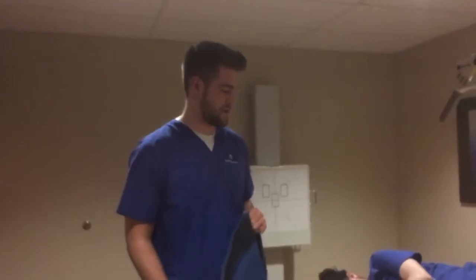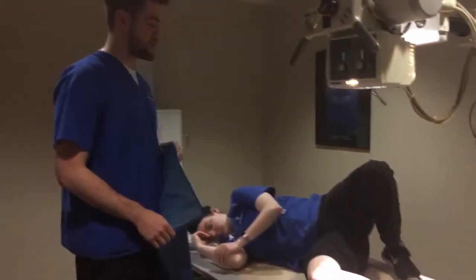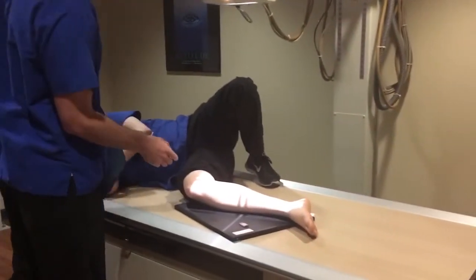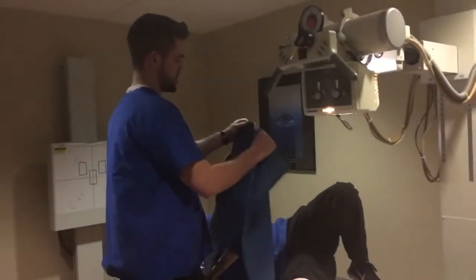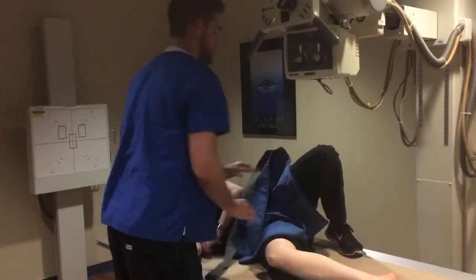Lateral projection of the lower leg. I had my patient rotate onto her right side to better put the lower leg in a true lateral position. I'll now shield the patient, protecting their gonadal region.